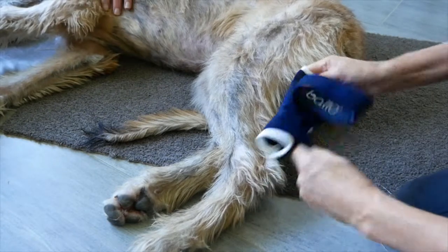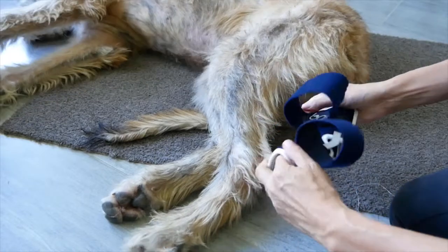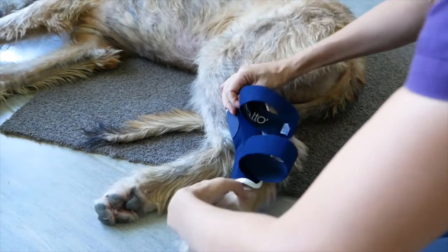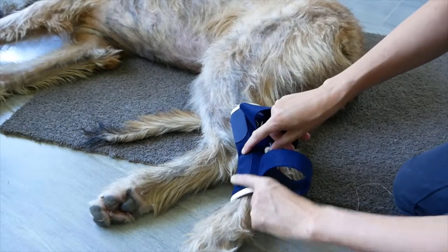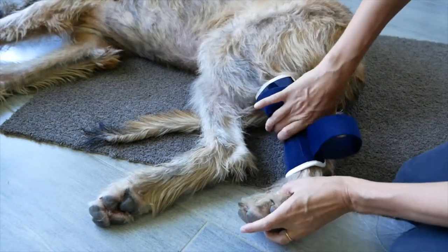To fit the brace, first open the velcro and straps. Following the shape of the leg and the brace, place the brace around the hock. Notice the point of flexion of the hock joint. To choose the correct size, measure the distance from this point to the toes.